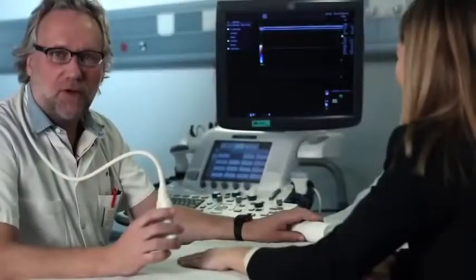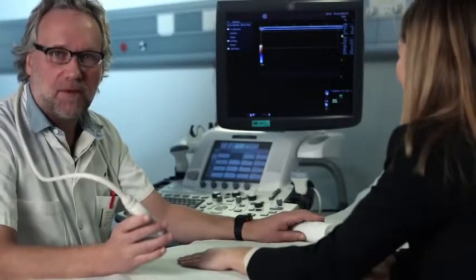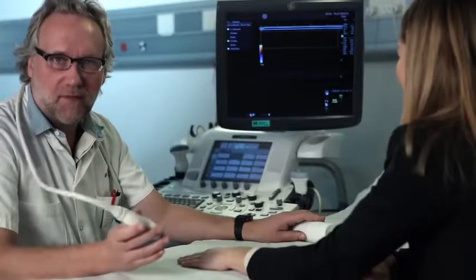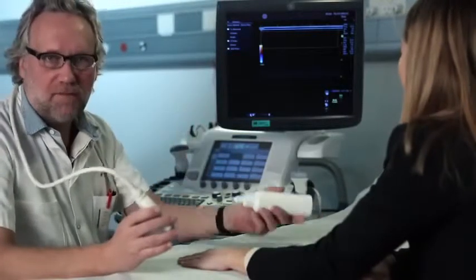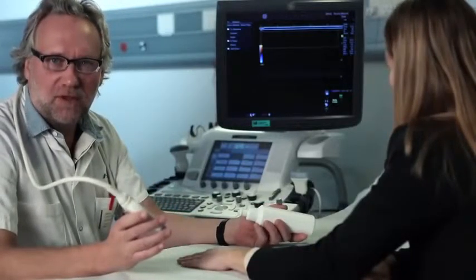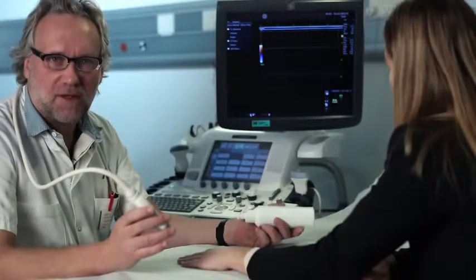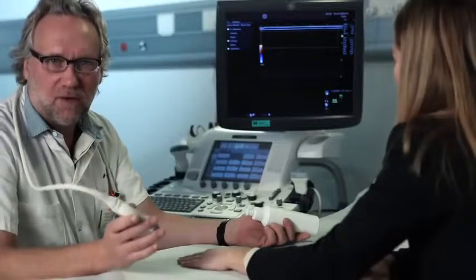Here's one of my rheumatoid arthritis patients. She visited 14 days ago with a flare-up in the wrist. I scanned her with color Doppler to quantify the inflammation, and then I injected her with a steroid. Today, she's here for her 2 weeks follow-up to see the results of the injection. We'll repeat the color Doppler exam and then compare the results with what we saw previously.